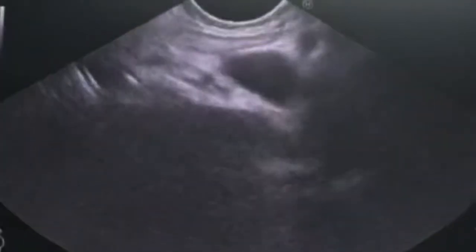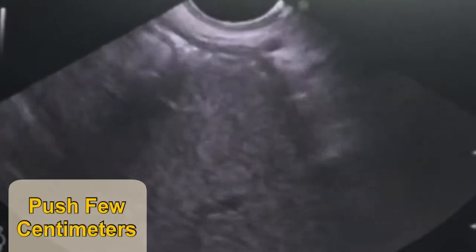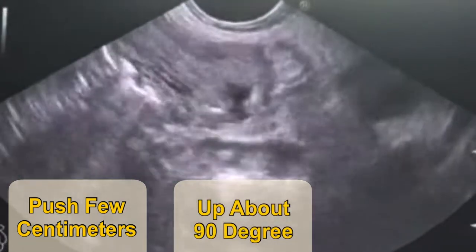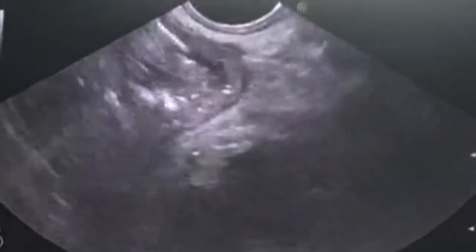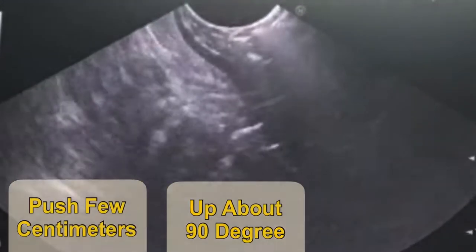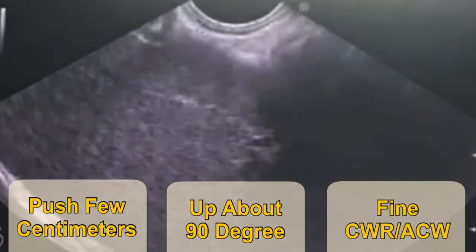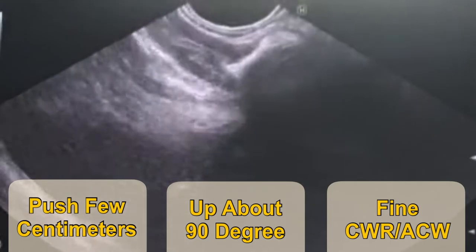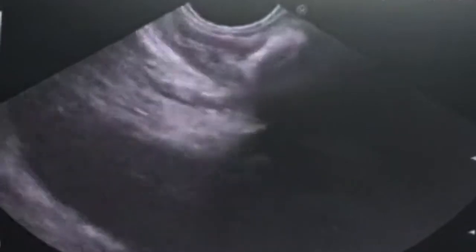We will proceed with up angulation and anticockwise or clockwise rotation. Yes, anticockwise rotation — this is the stone. This is the gallbladder with a very large stone within the gallbladder — a very large stone.